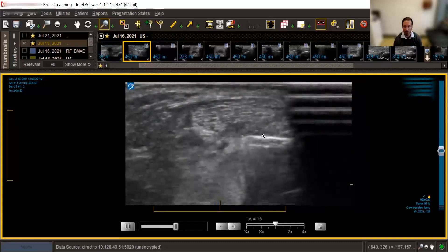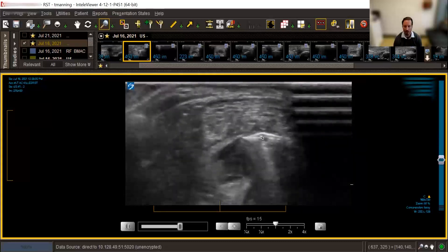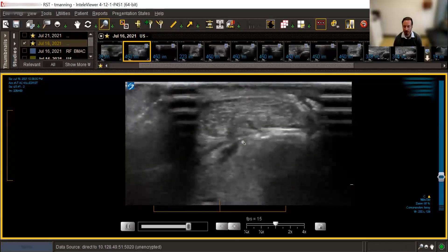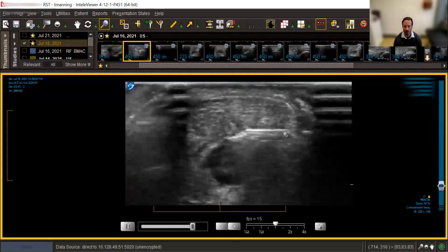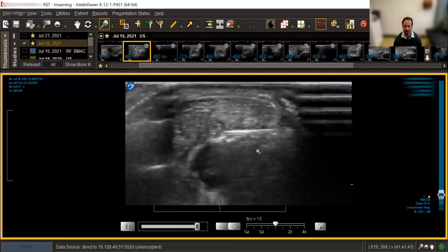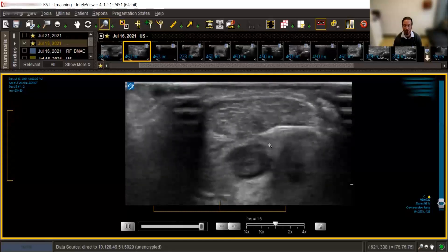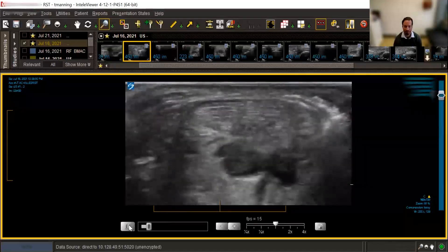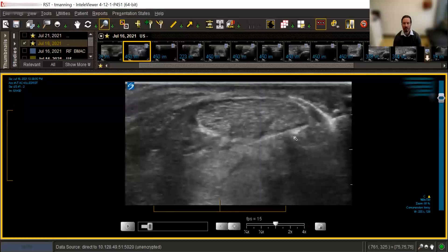This was also utilized to penetrate the Achilles tendon itself, as you can see in this area. But as stated previously, if you're not doing any tendon work itself, this can be left inside that fascial plane between the tendon and the underlying fat pad with very good success. Thank you for listening.